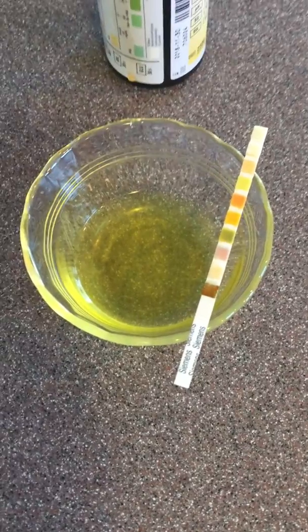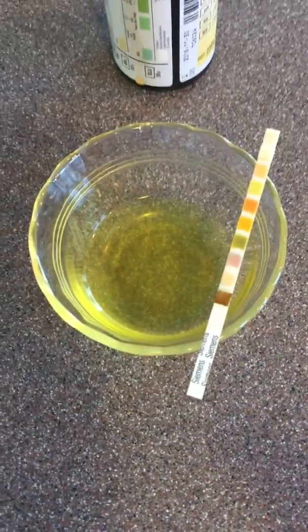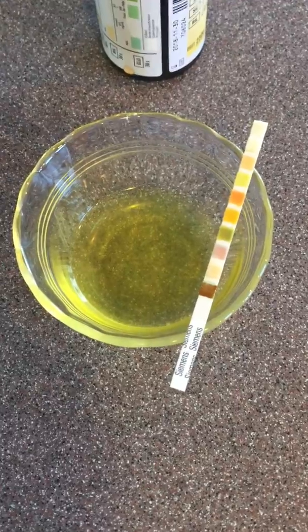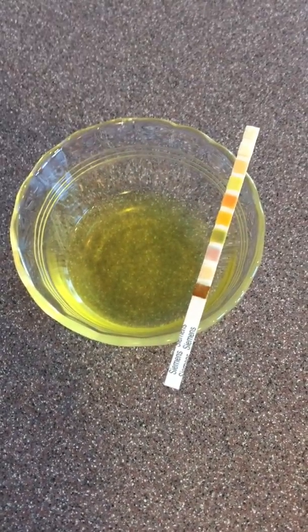dog. Now, if you have a diabetic dog, you may also be asked to test urine. You may not get the full set of strips. There is a special set of strips that just looks at ketones and glucose. But that is how you would go to collect, and that's how you would test that urine.